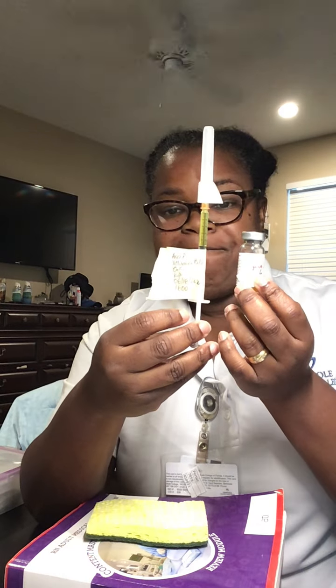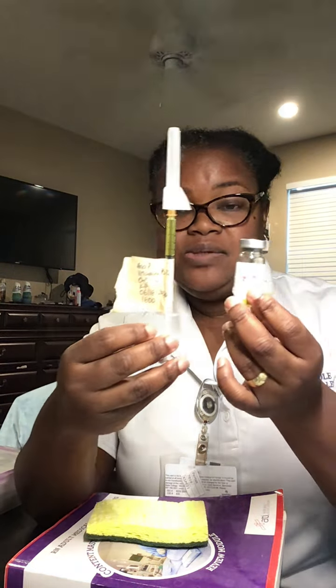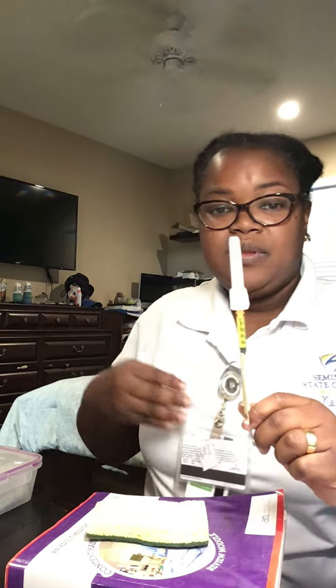And the route is subcutaneous, at 1600 tonight. The site I choose for subcutaneous is her abdominal area. For intramuscular, I'm going to use the deltoid muscle. Okay, wash my hands, put on my gloves.